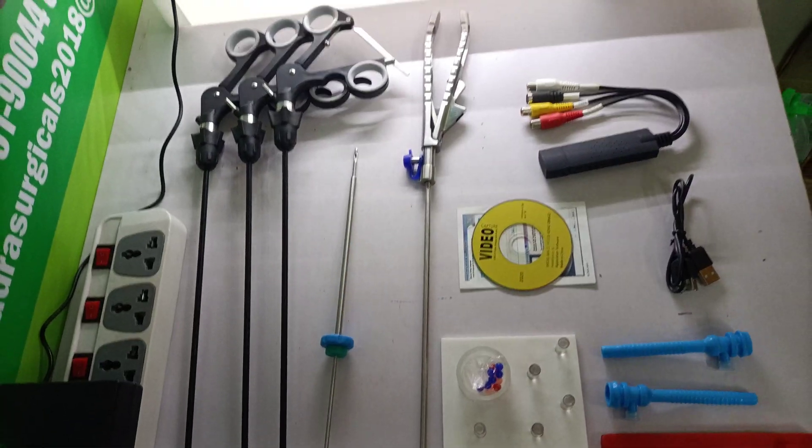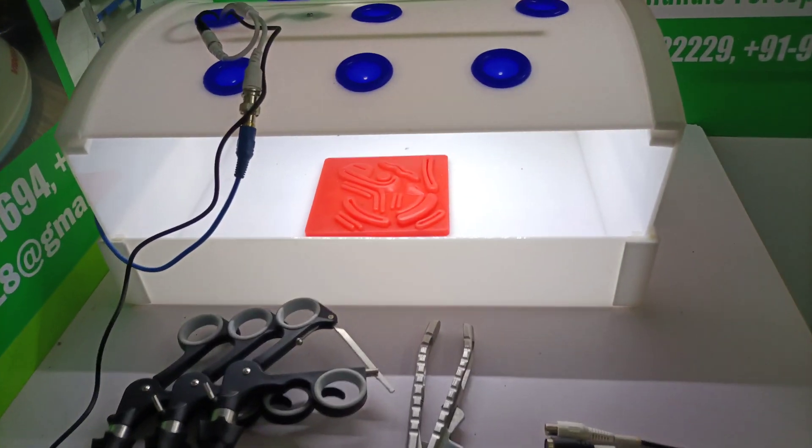All these instruments are reusable and autoclavable. You can use them in real surgery too.